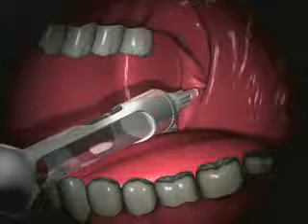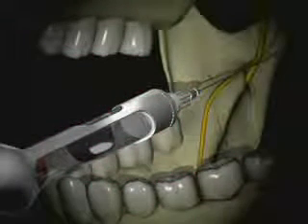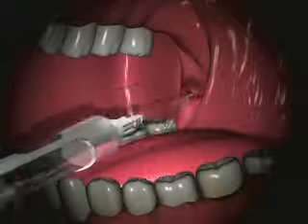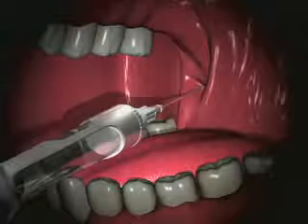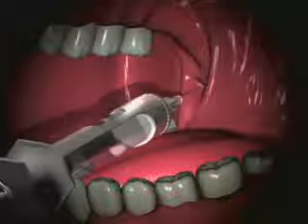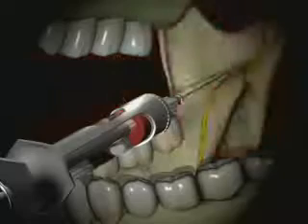If you do not contact bone after 25 millimeters, and the needle is almost buried, you should redirect by withdrawing somewhat, but not completely, and move the barrel of the syringe more laterally and advancing again until bone is contacted. You should repeat this procedure as necessary.